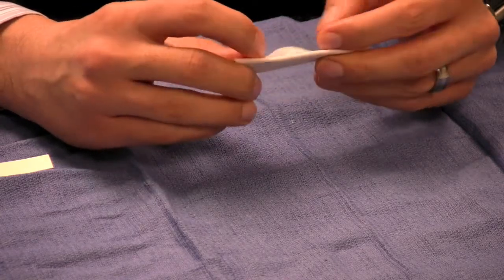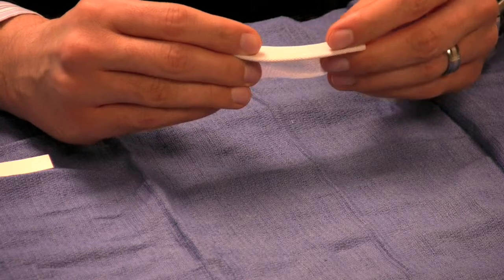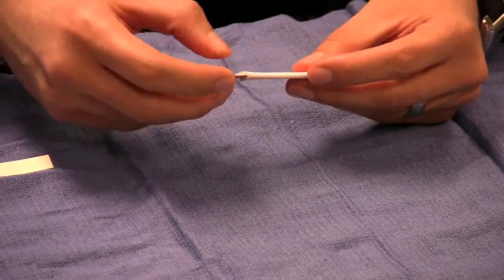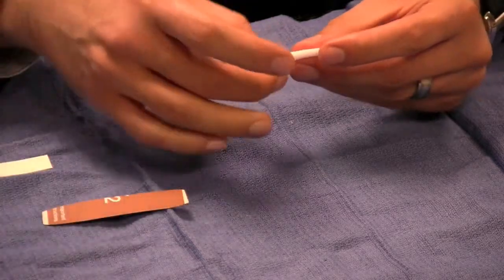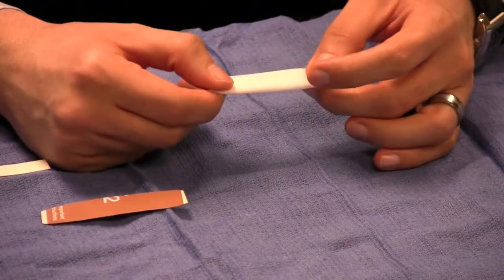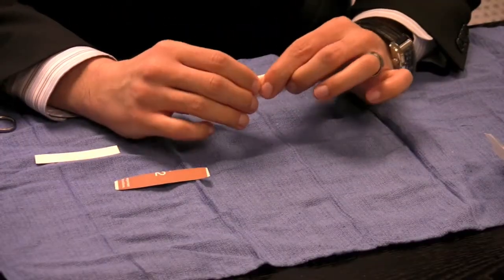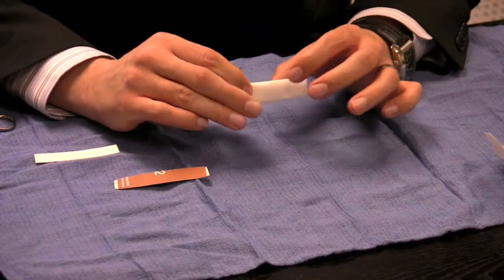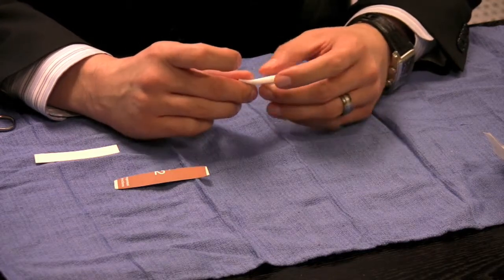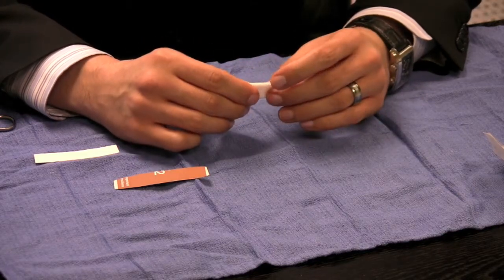Whether it's a small oval, a larger oval, whatever I need, I can do that on the OR table. But over here, I'm essentially just creating a template, and this is giving me width. Now, this is what I would consider a small chin implant, but you can roll it into however many layers you need, 10, 15, 20, 25, 30 or more layers. The thicker it is, obviously, the larger the chin implant is.